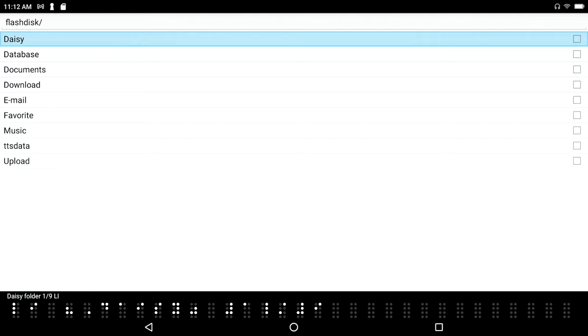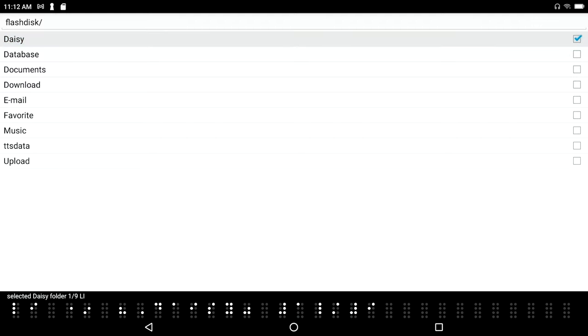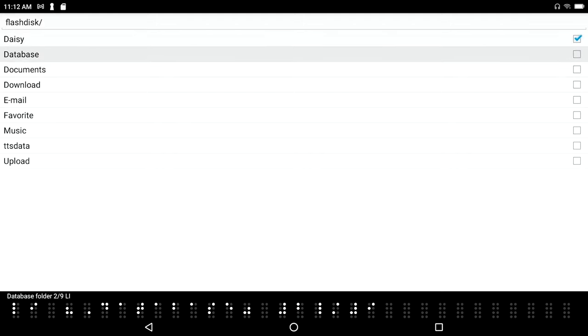Selected daisy folder 1 of 9 list item, okay. And I've got 9 items here. I'm just going to continue down. Database folder 2 of 9, there's my database folder. That's on the Braille Sense 6, that is a new thing on the 6. You won't find that on your Polaris.